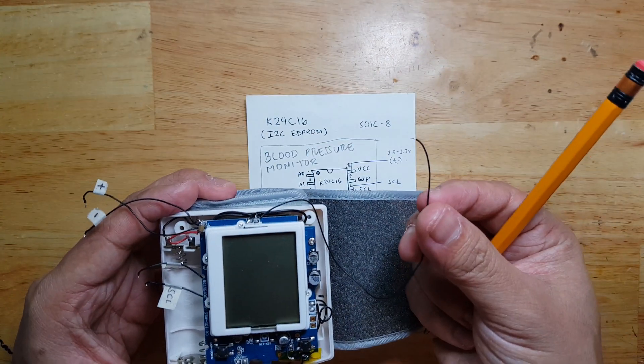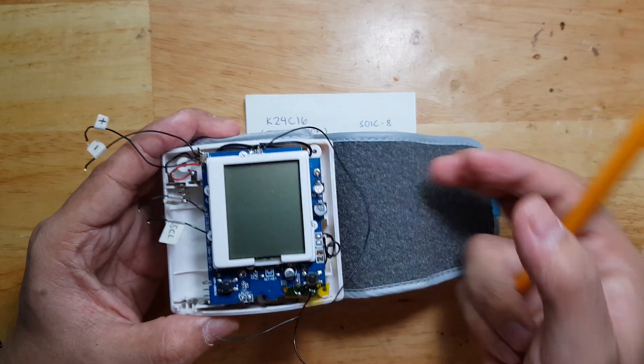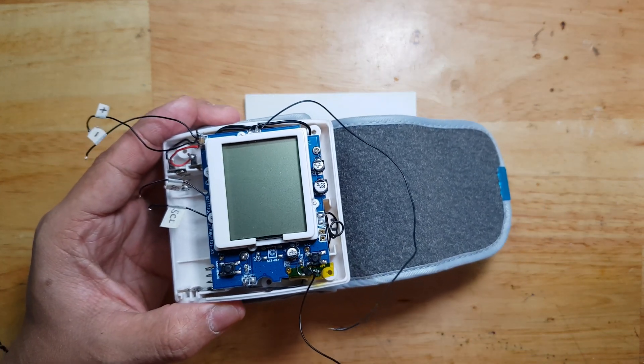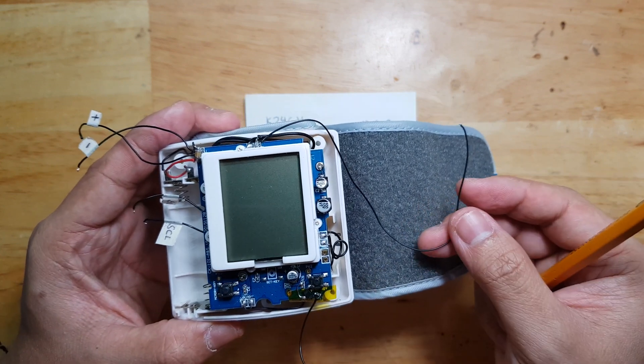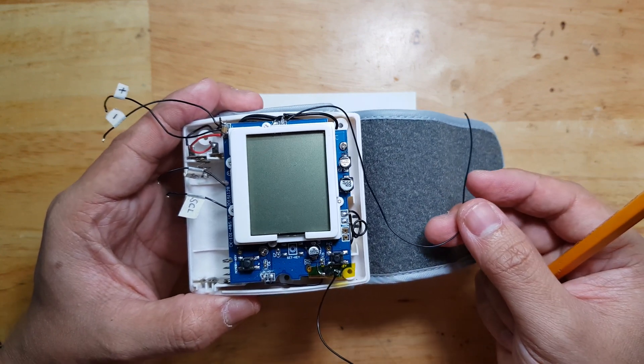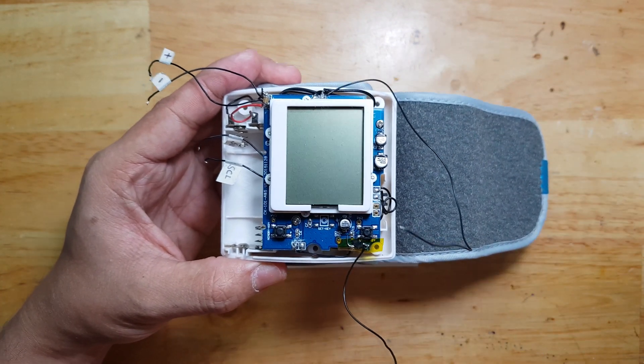This valve will indicate when the pump is already done measuring the blood pressure of the patient. Once done, we can get the value from the I2C EEPROM.